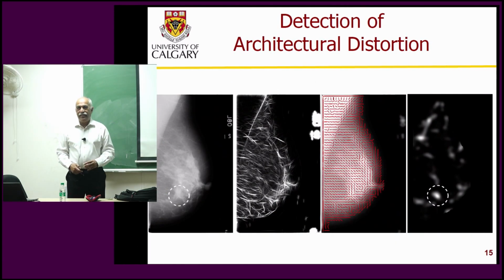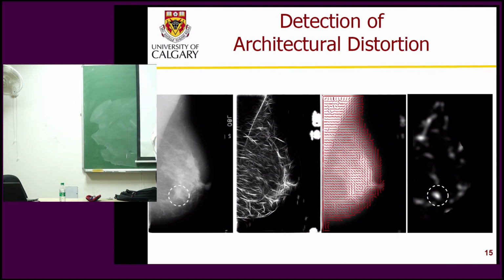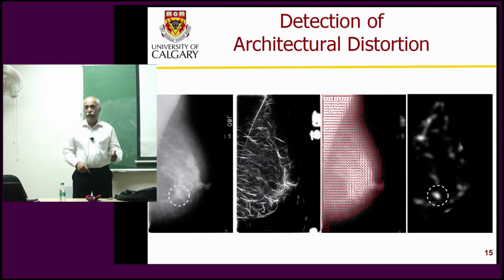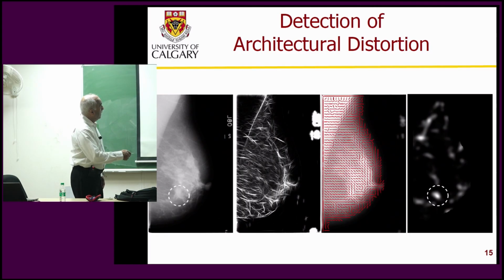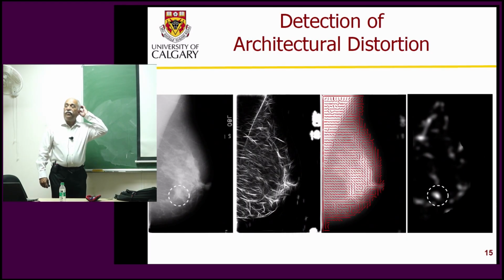But it's not so easy. When you apply it to a whole mammogram, again the window is there, applied on top of this field, and you run all over the image, and you create this node map. And this is the node map. This is the area in the MIAS database where architectural distortion was identified by a radiologist or whoever marked the database. The magnitude field, only oriented textures, the density information is thrown away. The DC gain of Gabor filters is 0.